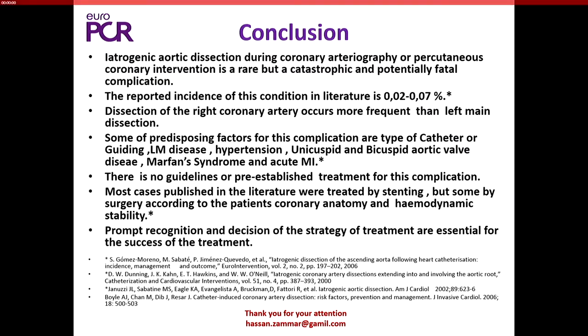If you have availability of IVUS, I would encourage you to use it, because I've seen people stent from the false lumen into the true lumen, and once the stent's in, it's game over. You could do this 100 times, and half the time you may end up in the false lumen. Hopefully you will not deal with these cases 100 times.